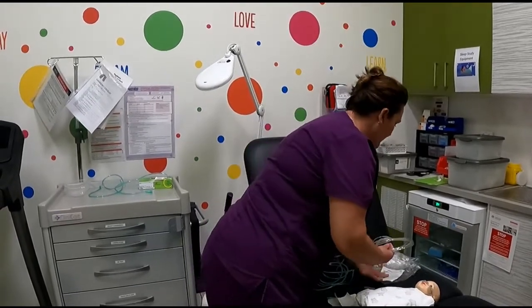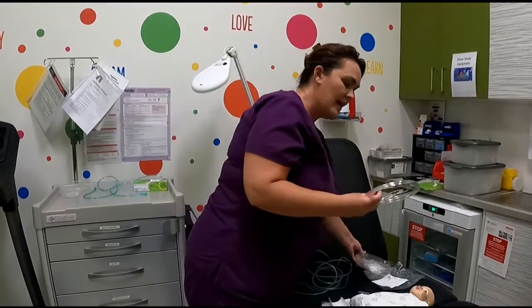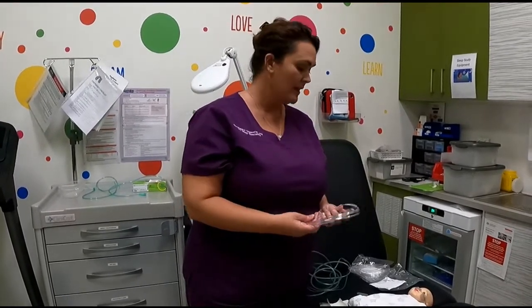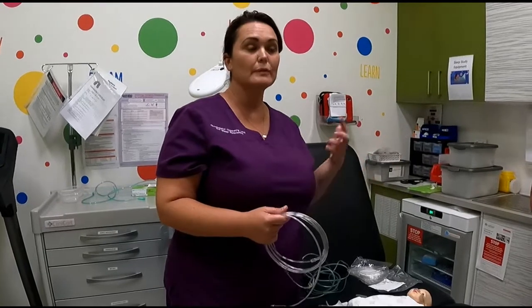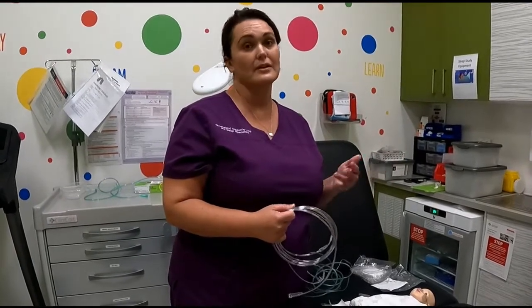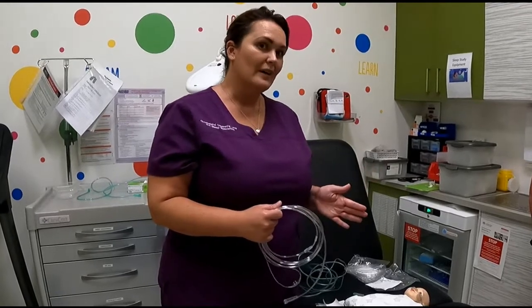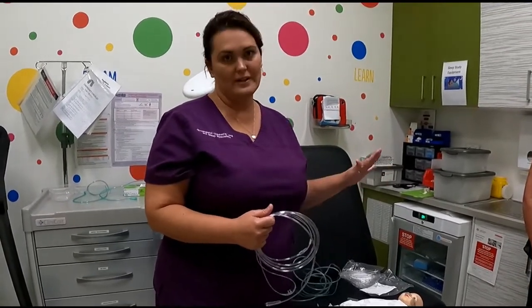What you'll get delivered with your oxygen is these prongs. They're clear and you'll get approximately 4 a month. That's how many you're allowed with your MAS supply. They'll also give you some to take home from the hospital. If you're running short on prongs, just when you reorder your oxygen, let them know that you also need new prongs. Because you get 4 a month and you're changing them every week, it's usually more than enough.